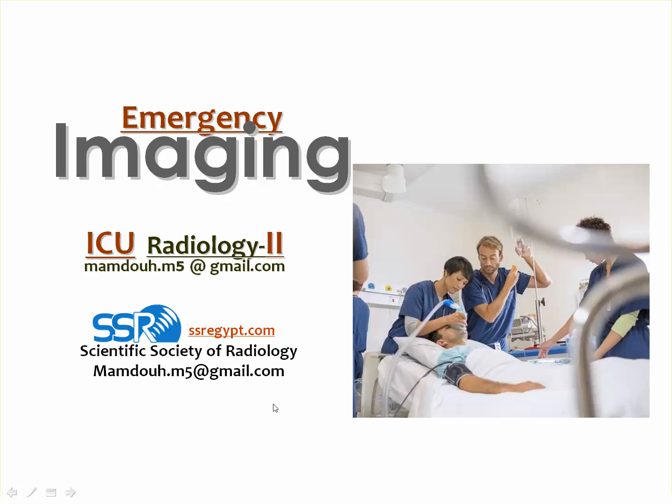Dear colleagues, this is the second part of the topic of intensive care radiology. In the first part of this talk, we have discussed most of the tubes and catheters, and also the lines used for patients inside the intensive care unit. There are only two remaining devices. I will mention them now.